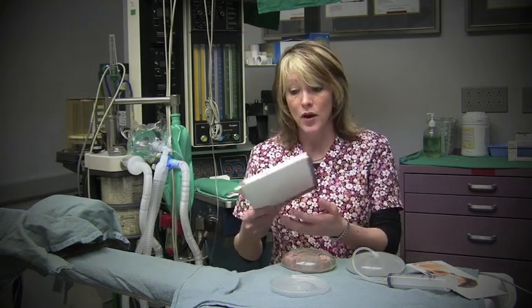The second thing that they changed is that they added more filler to each shell. And by adding more fill, it protects the shell and keeps it from wrinkling and rubbing on itself, and therefore adds lifespan or longevity to each implant. Today, silicone implants also come with warranties, and it will vary depending on the manufacturer that you choose, but your surgeon should give you a booklet similar to this, and you should always keep these with your other important papers. On a lighter note, patients will always tell me that they prefer the feel of silicone over saline. We also find that silicone implants tend to weigh less on your tissue, therefore they age better with you over time.